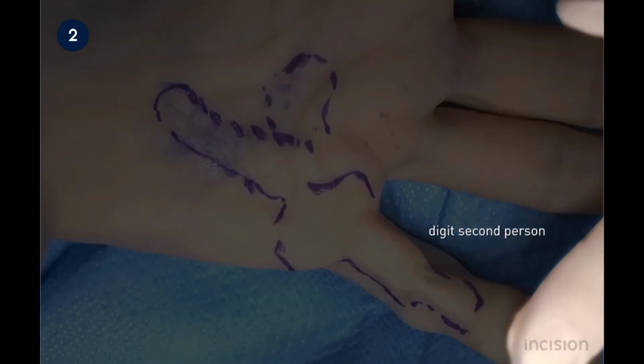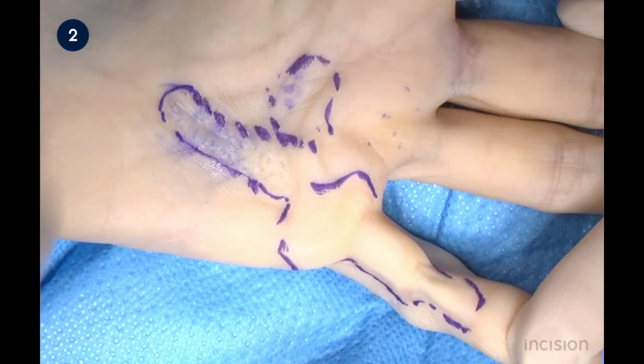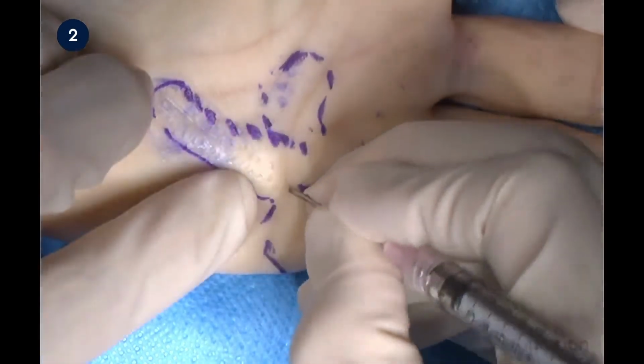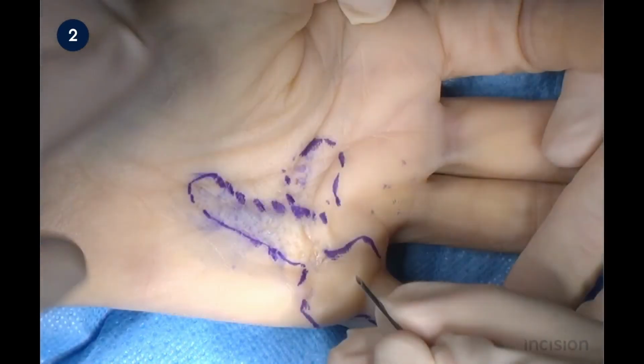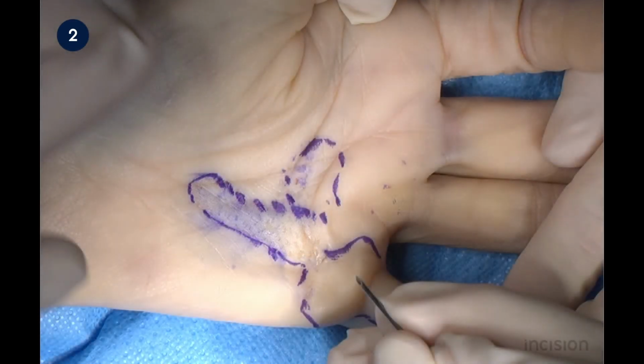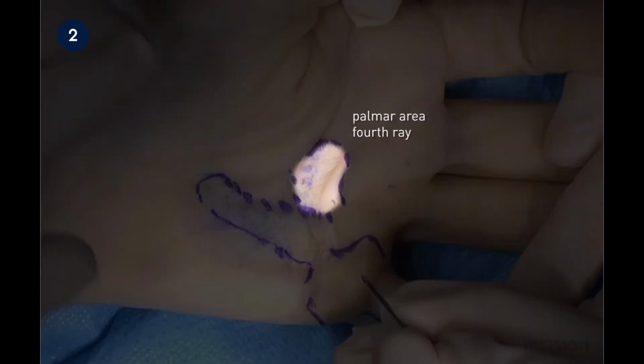Note that the cord is tensioned by a second person using gentle passive extension of the affected digit. Alternatively, the surgeon can use the non-operating hand to do so, or a lead hand can be used. Tensioning the cord is very important as this moves the cord more superficially, which makes splitting the cord easier. Also, deep introduction of the needle is not necessary, thereby reducing the risk of injuring surrounding nerves or arteries. The palmar area of the fifth ray, now highlighted, is now softened. The procedure is continued on the palmar area over the fourth ray.